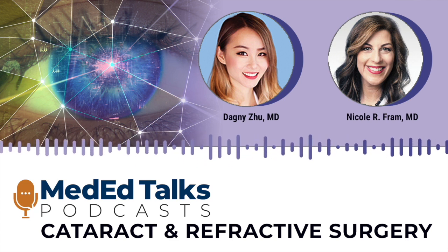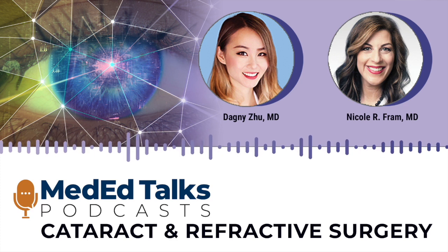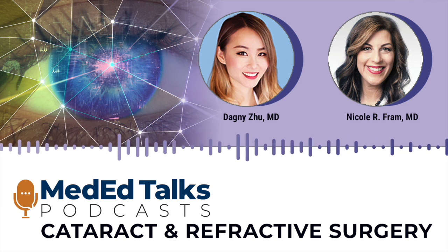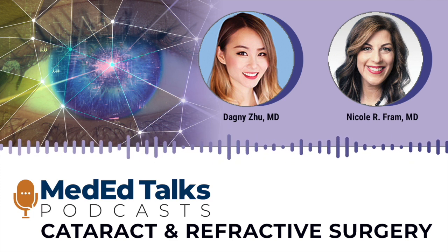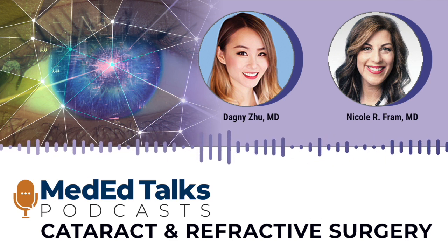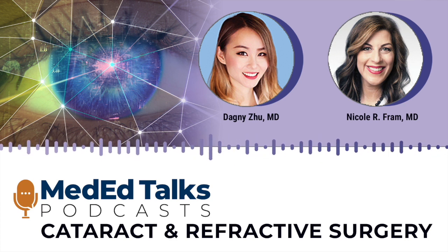And it technically means that you may not have to mark in the preoperative area. I always mark because I have had times where I get into the OR and the reference image isn't there. And so I don't want to sit the patient back up and mark them after I've realized that. So I think it's your parachute to always mark in the preoperative area.